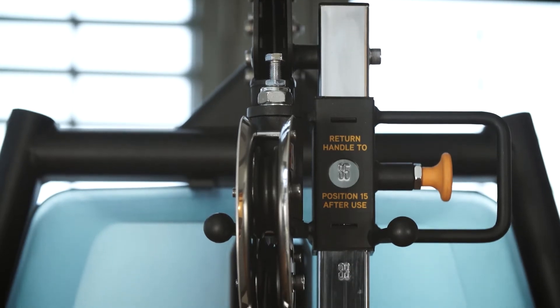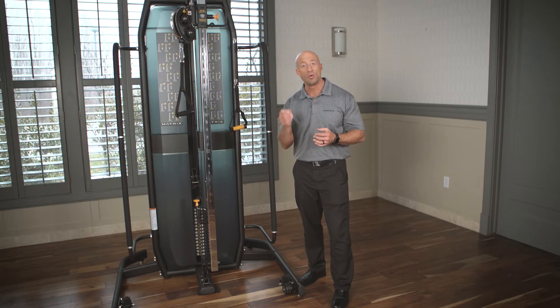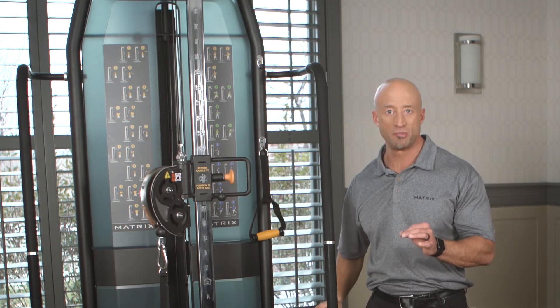It has easy one-handed adjustment so both therapists and users can do it easily and quickly when they're modifying the machine between different exercises. Very simple.